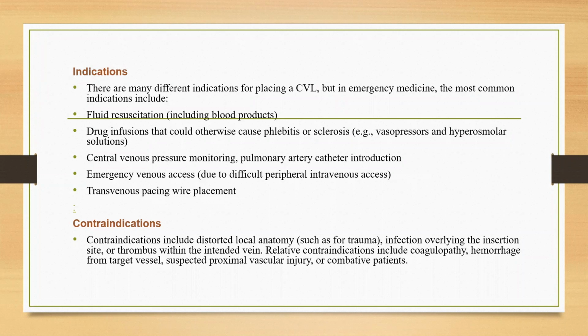Indications: there are many different indications for placing a CVL, that is central venous line.